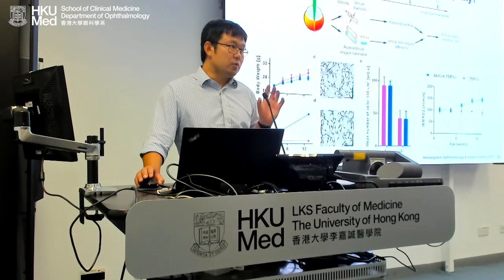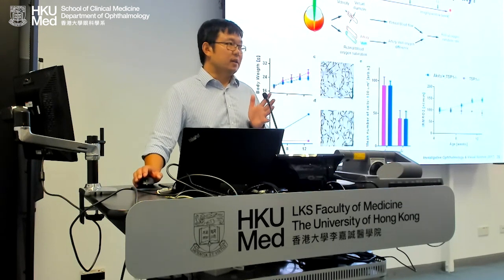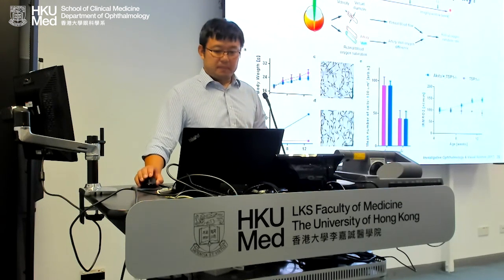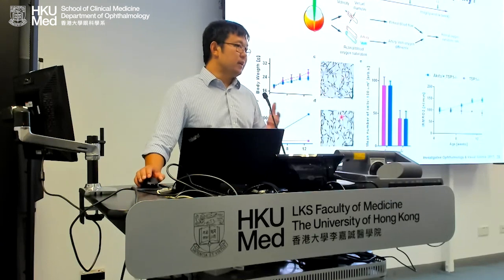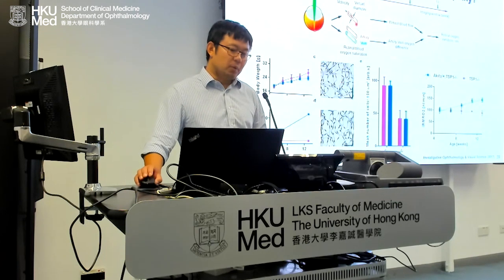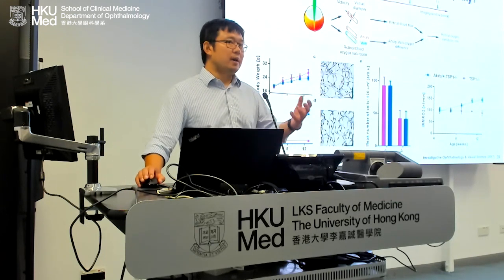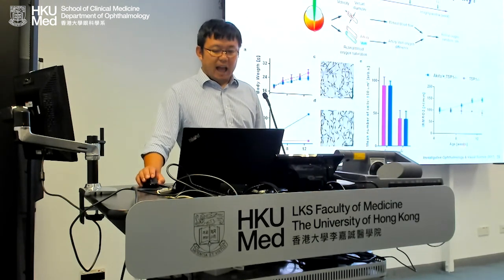We imaged the group of animals at the 5th, 7th, 9th, 11th, and 13th weeks. These are considered healthy at the time, and we validated that from the 5th week to the 13th week there's no capillary change. The body weight keeps growing because they were young mice, and the glucose level keeps growing. So the diabetes is getting severe.